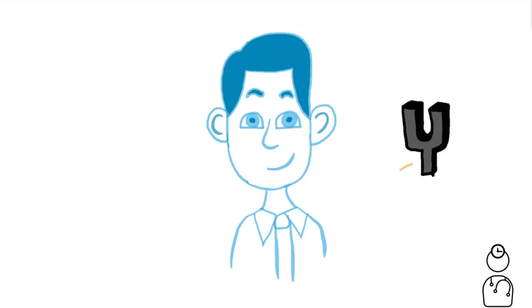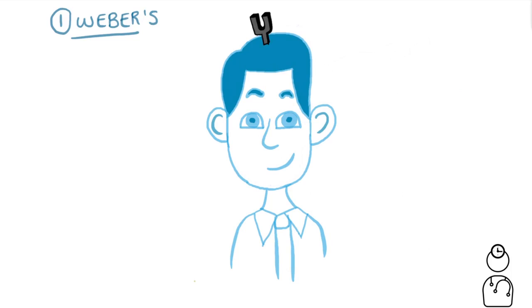First up, we'll need a 512 Hz tuning fork, and we're going to start with Weber's test, but it doesn't really matter which one you start with. We strike the tuning fork so it starts vibrating, and then we're going to place it in the middle of Bob's forehead. We're going to ask him which side the sound is loudest.